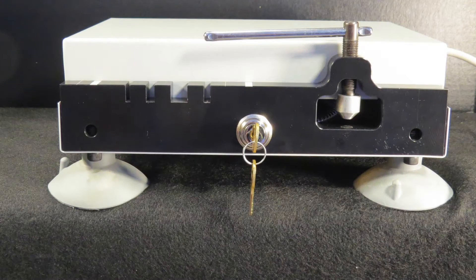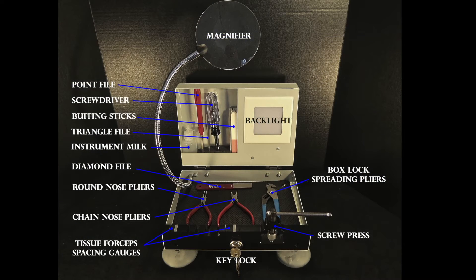Section 1: Adjustment Station Components and Tool Function. In this introduction to the adjustment station, its components and tools will be identified along with an explanation of their function.